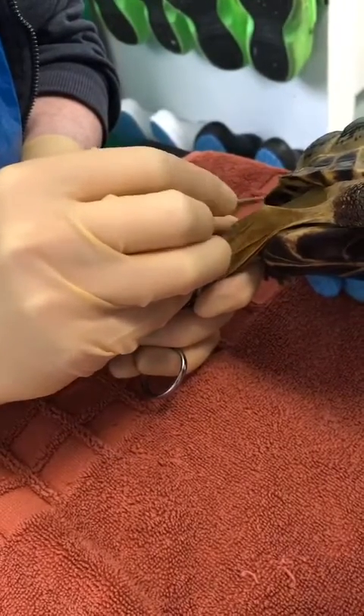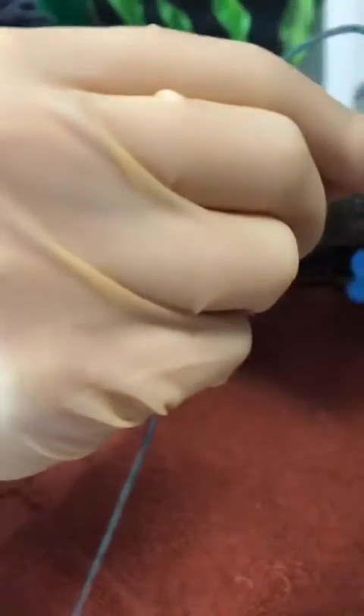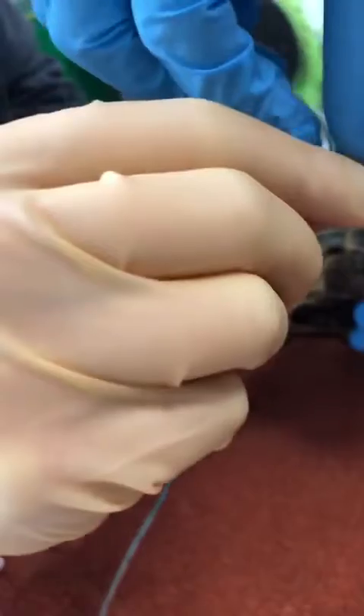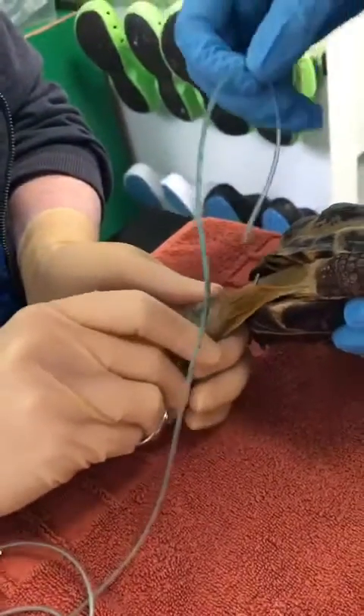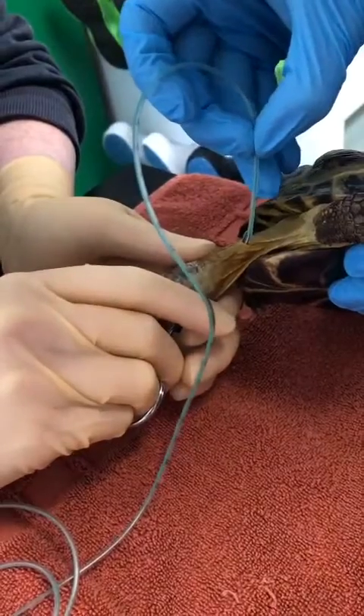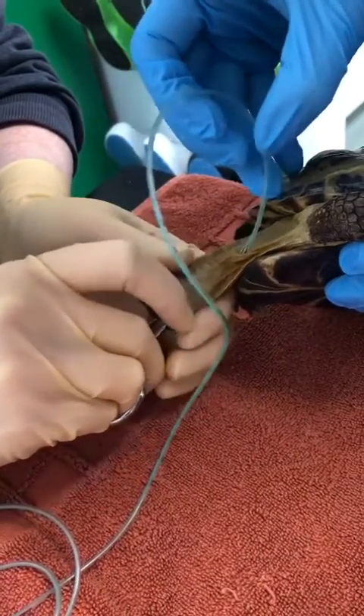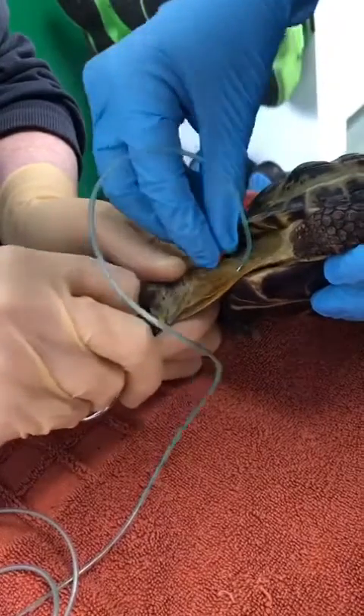We're just incising through so they're poking through. Pass me the tube and pop the end into the open forceps. We can then grasp that tube, bring it through, and then back out of the mouth.